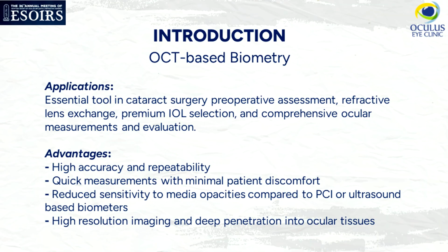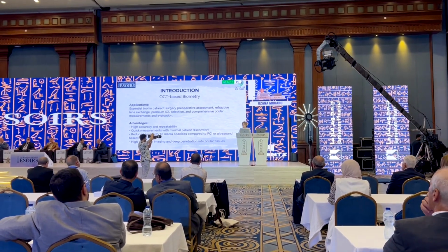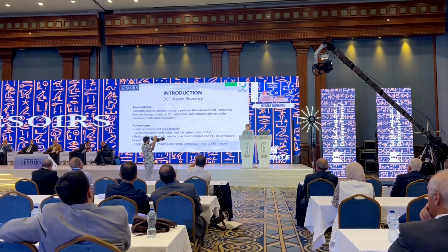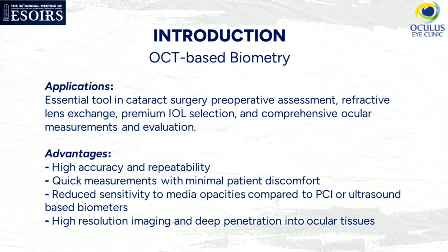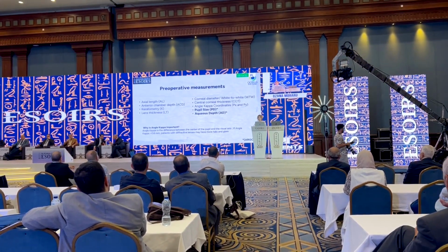As we know, there are several applications of OCT-based biometry. It is an essential tool in cataract surgery preoperative assessment, refractive lens exchange, premium IOL selection, and comprehensive ocular measurements and evaluation. And it has some huge advantages in comparison with the other types of biometries. It has high accuracy and repeatability, quick measurements with minimal patient discomfort, reduced sensitivity to media opacities compared to PCI or ultrasound-based biometers, and it has high-resolution imaging and deep penetration into the ocular tissues, as you see in the clinical examples that I'm going to show you.